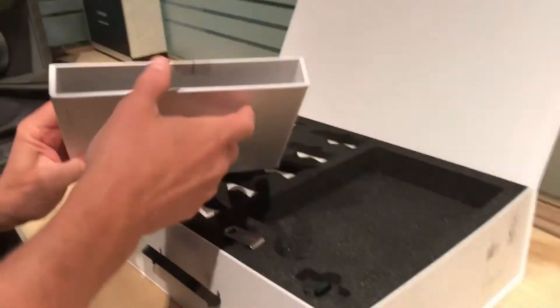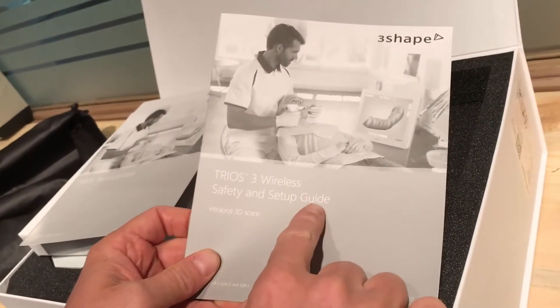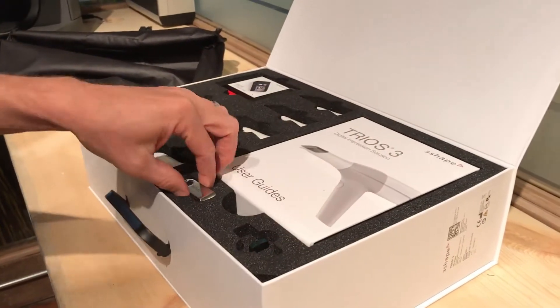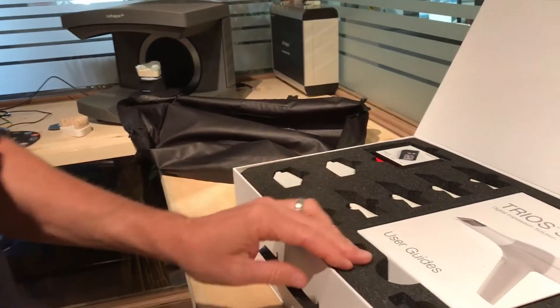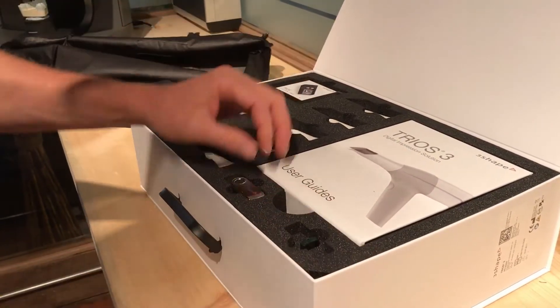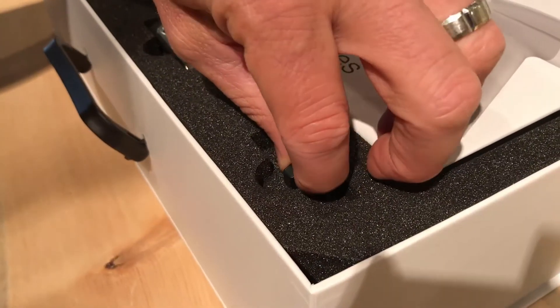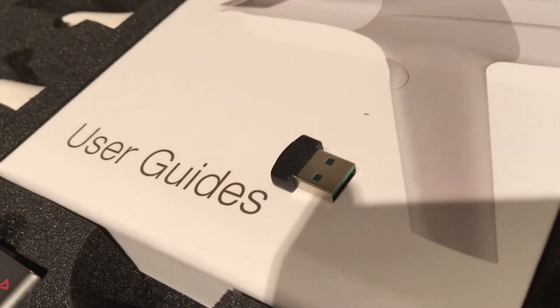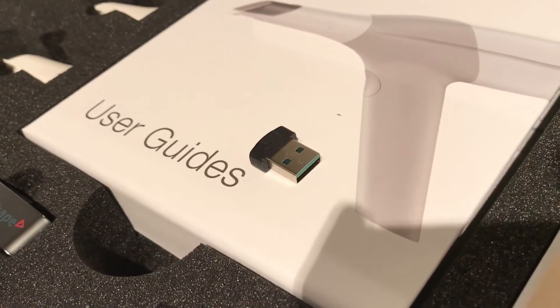No more removable mirrors. Then if we look, we essentially have the Trios 3 wireless setup and safety guide, some technical data which we would speak to in training. And then there's a little Three Shape item — this is where the dongle used to be, and I believe this is the new dongle. As you can see, it's tiny. I'm just going to grab a production dongle here to show you the difference between them.